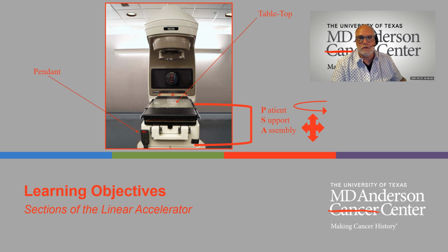Now we will look into the accelerator to determine how the electron and radiation therapy beams are made.